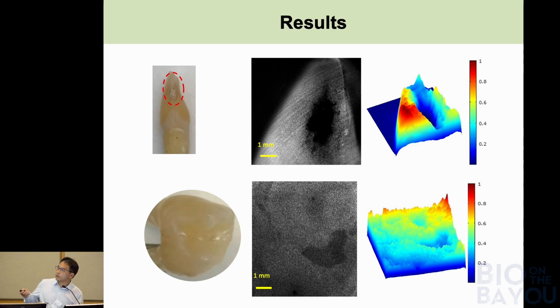This will show there's some loss, which can be categorized as early stage caries. It may also show some loss on the tips of the molar teeth. So this is the first roadblock overcome, preventing Raman imaging from reaching clinical settings for caries detection.